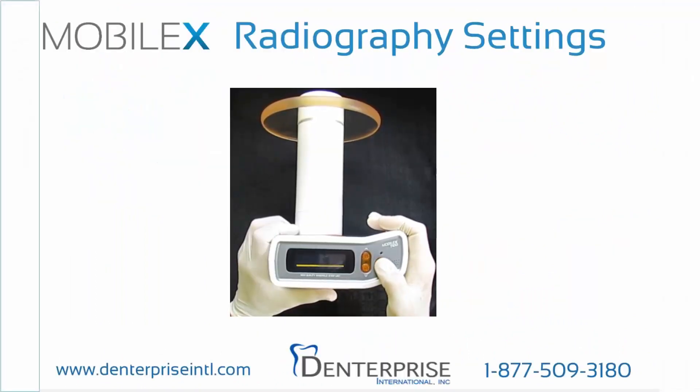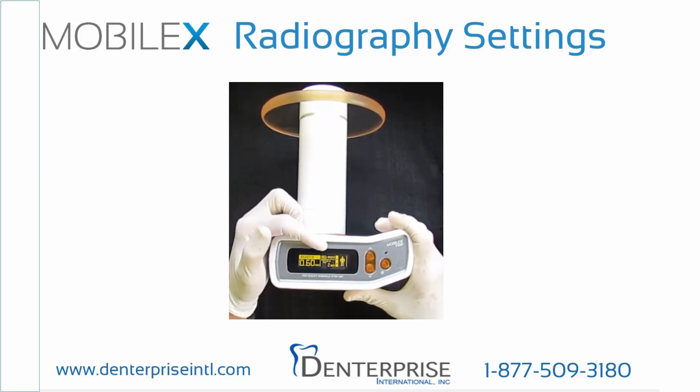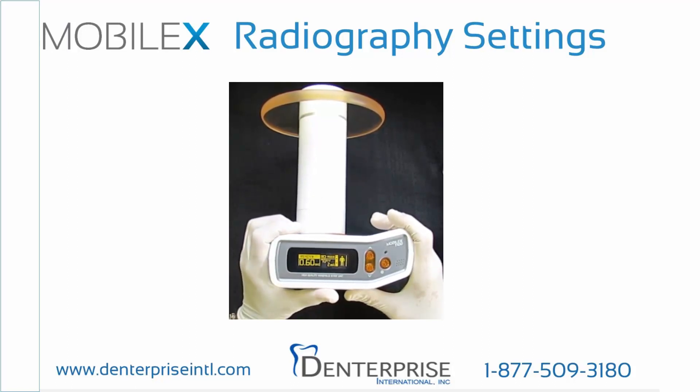Press and hold the power button until the display shows ready. The display panel will light up and you'll see a battery power level at the top center of the screen. Three bars is an indication of a fully charged battery. If the battery charge is too low, MobileX will not emit an X-ray. When the battery level is depleted to a single bar, we recommend the battery be recharged.